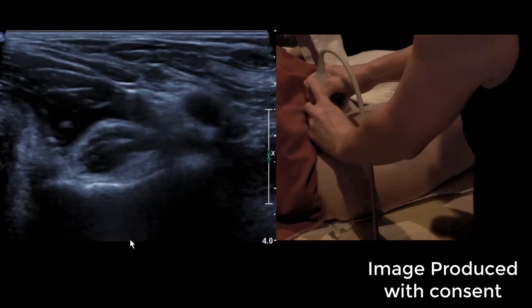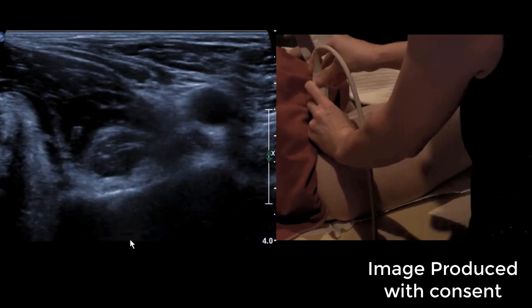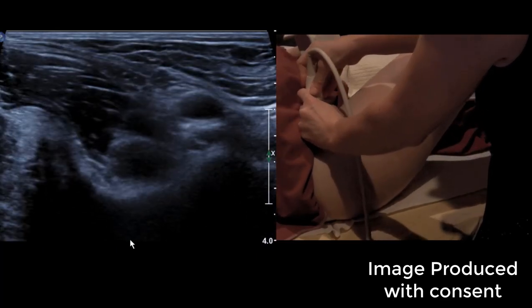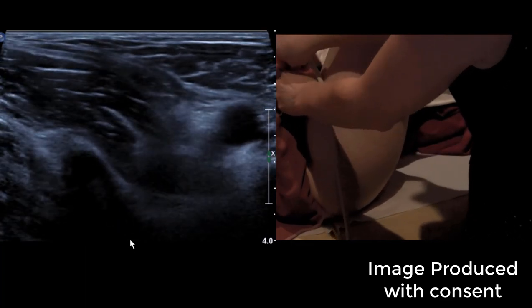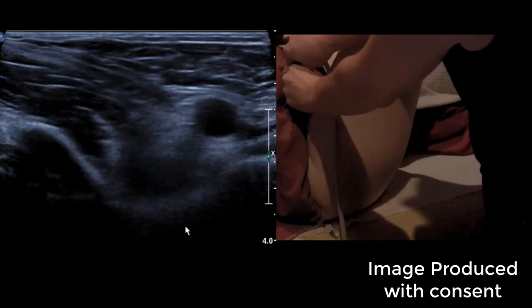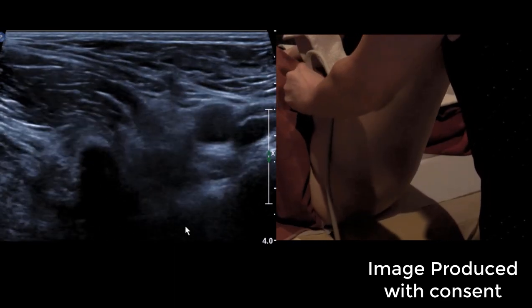So we're going to use my left hand. Now, my left hand's just guiding, my right hand's putting the pressure. So if you can bring your knee up to flexion. All right, now can you see our tendon has popped right up off the bone here? Okay, now we're going to bring it out to the side and just hover.